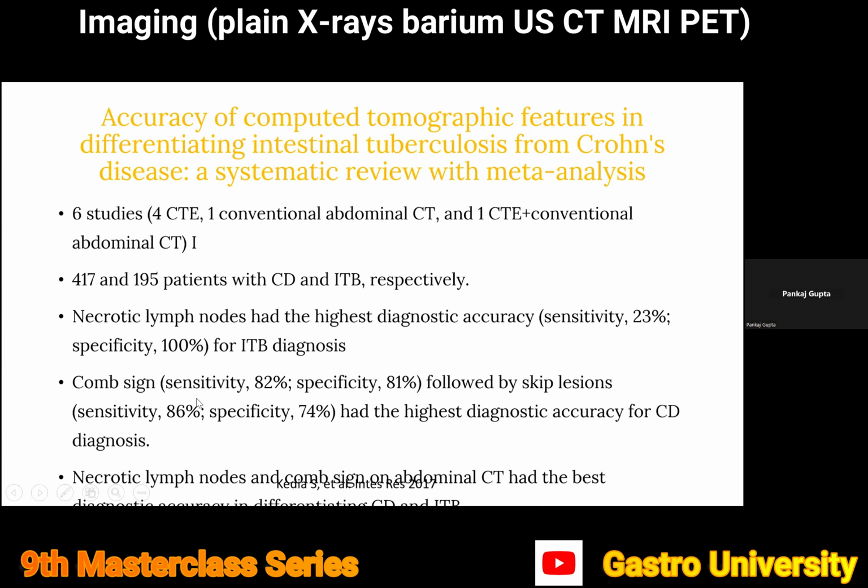For the diagnosis of Crohn's disease, the comb sign, which is basically increased mesenteric vascularity, followed by skip lesions, has the highest diagnostic accuracy.